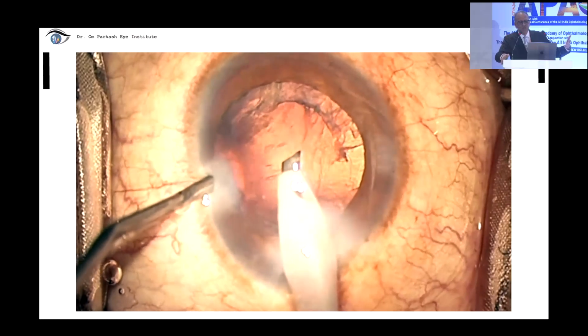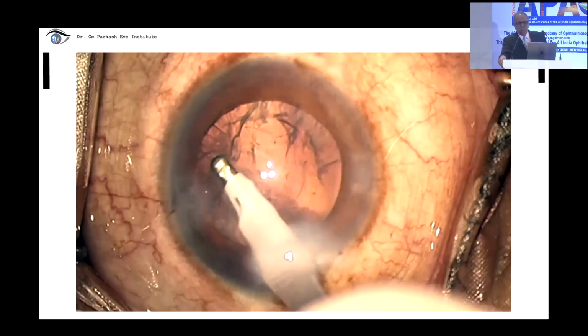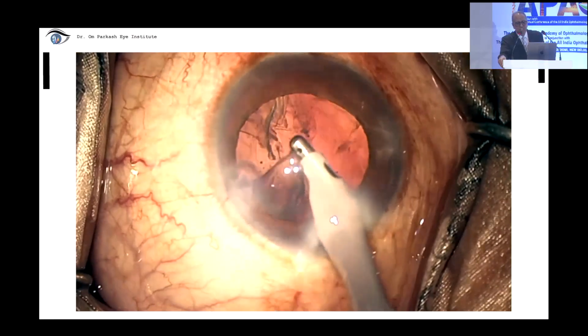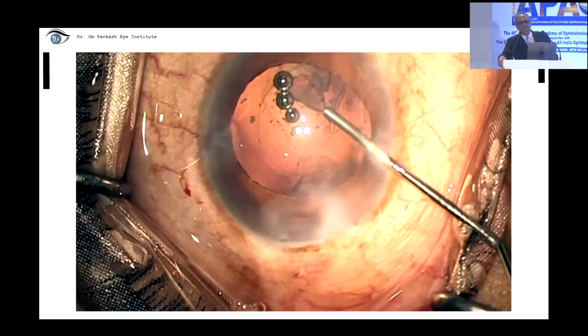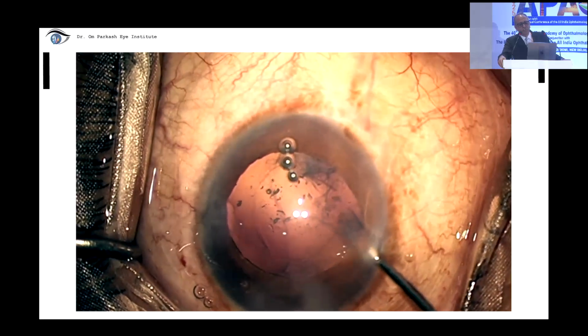So once that was done, the stable chamber settings, typically a bimanual should have been done because you want to separate the different levels of irrigation and aspiration. I retracted the sleeve, and this is the Gills and the James P. Gills from Florida. His technique of dry aspiration is being done with a 25 gauge cannula.